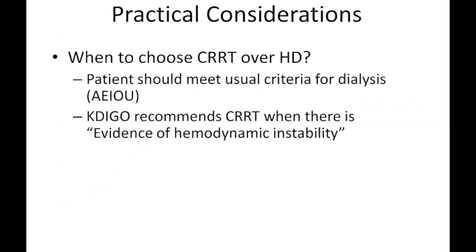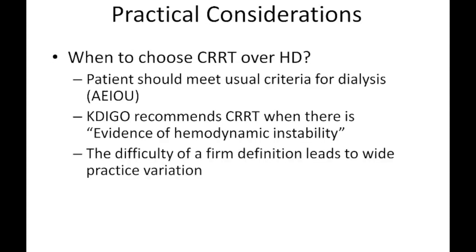In terms of official recommendations, our standard setting group would say evidence of hemodynamic instability. The truth of the matter is patients that are on a stable dose of pressor can tolerate hemodialysis with some amended settings pretty well, and one can run a CRRT pretty intense to almost mimic hemodialysis. So really there is a fair amount of overlap, but generally at UVA, pressor-dependent patients will require CRRT. That's usually what we do.